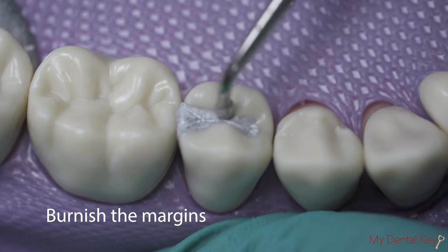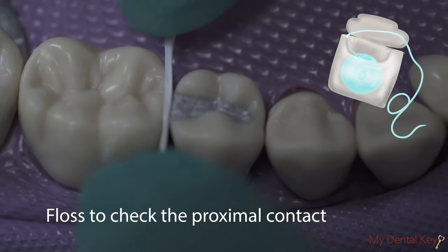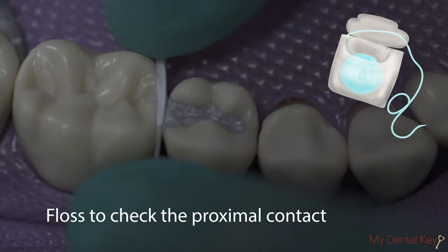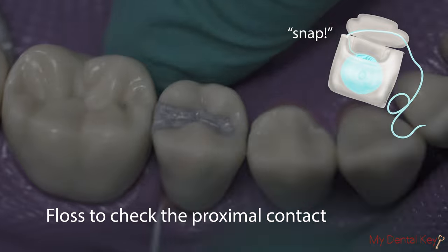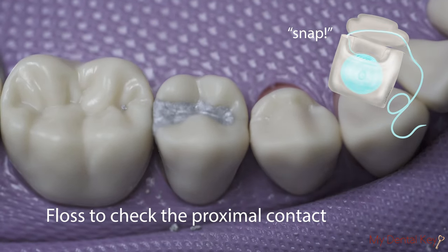Now, burnish the margin circumferentially using your small ball burnisher. Use floss to check the proximal contact. Floss in the gingival direction and pull the floss laterally through the embrasure to avoid dislodging the restoration before it has fully set.